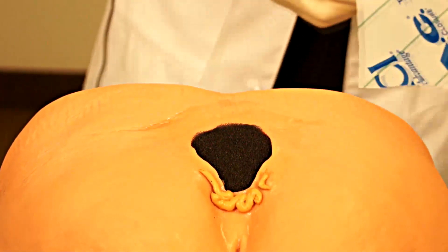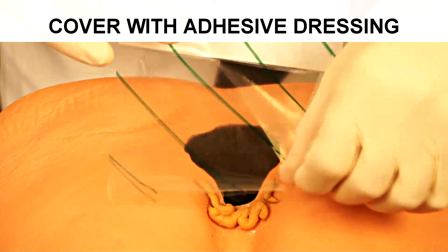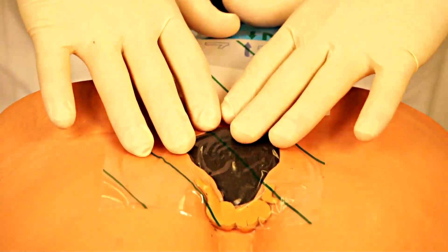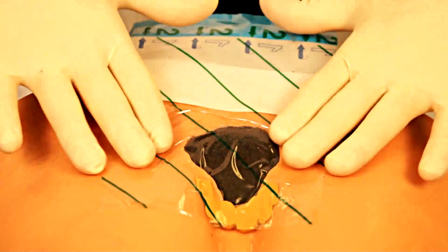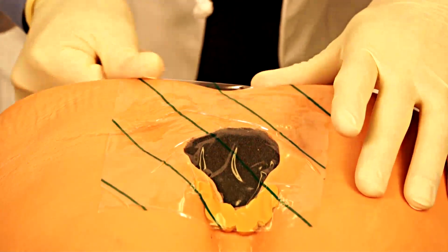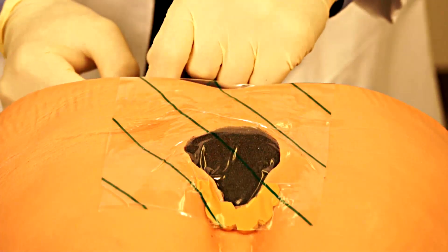Once you've applied your stoma paste, you can then apply the adhesive directly over it, as you will see in this demonstration. Your adhesive can stick directly to the stoma paste that has filled the deficit. You can gently mold the stoma paste with your fingers, and this will greatly aid you in achieving a seal around the wound and over the negative pressure dressing or the sponge.